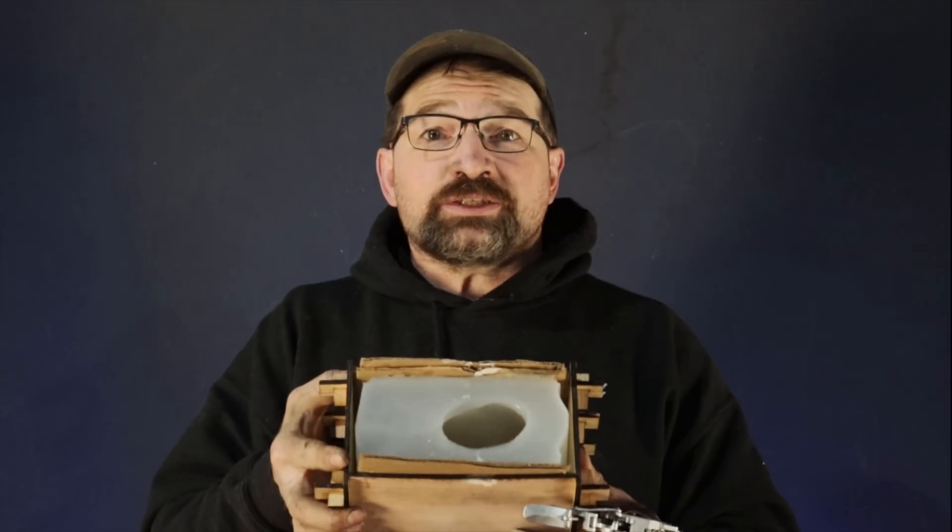The previous video concluded with pouring the silicone to make a master mold of my residual limb. In this video I'll be taking a very high level view of the artistry that goes into taking a plaster cast pulled from the silicone mold and refining it in order to make a buck that will produce a well-fitting fiberglass shell.